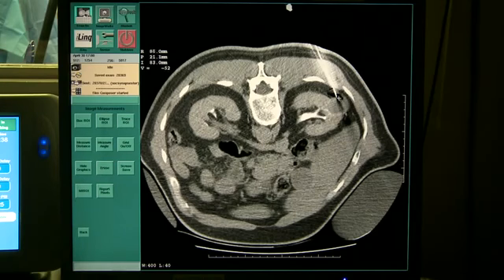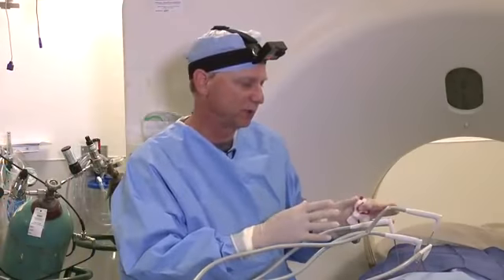So when you plan your cases, always make sure you can do something with the back end of the ice. So I'm going to put a marking needle down here and take a picture and then place another probe. So we've got our 4 probes in place now.